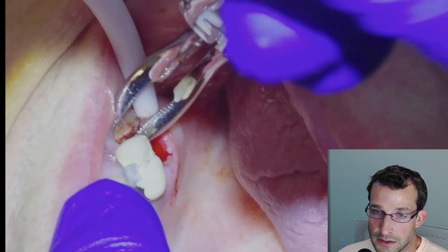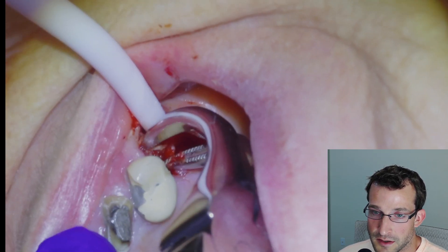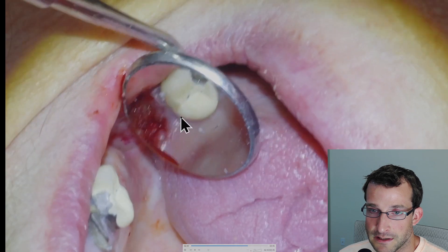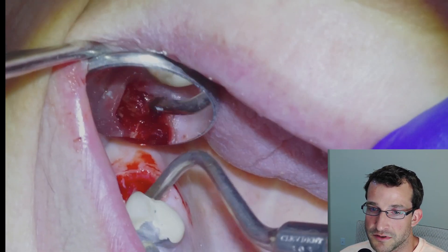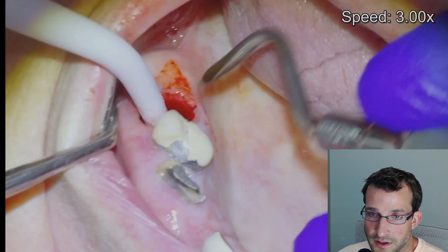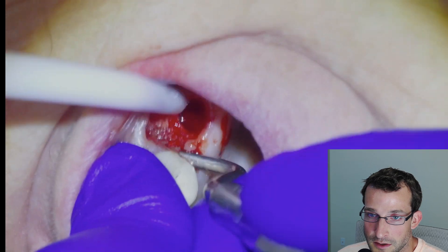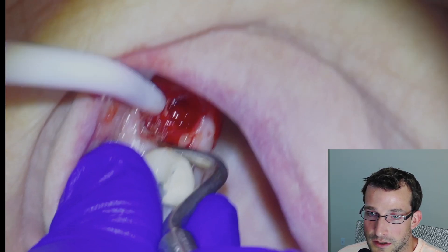We'll do the same thing for the distal buccal root and then the mesial buccal root. You can actually see the nerve there. We did not have enough purchase to grab the root with the forceps, so we're just going to take our root tip pick and see if we can find some purchase somewhere. We are unfortunately able to do that on the mesial aspect of the root, so we're just going to fish around and put some elbow grease into it until we are able to elevate the root tip.